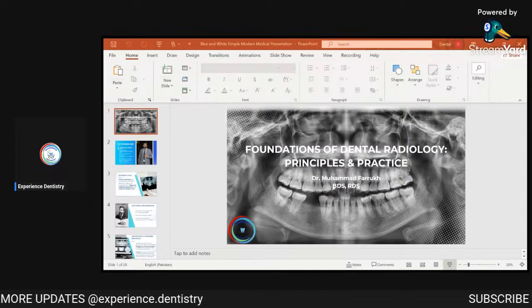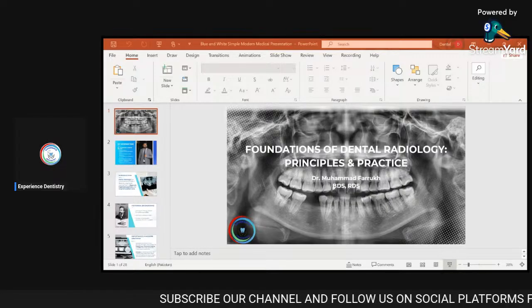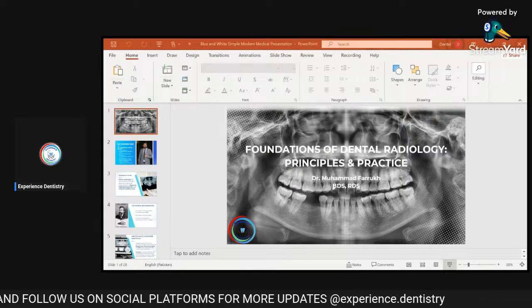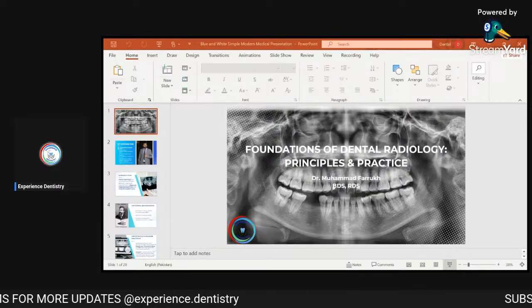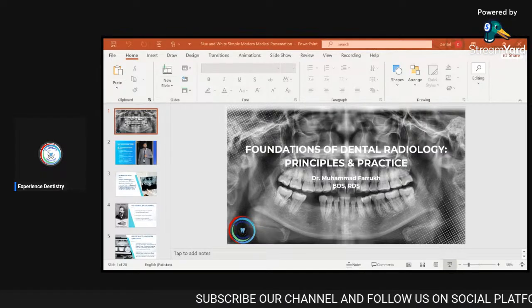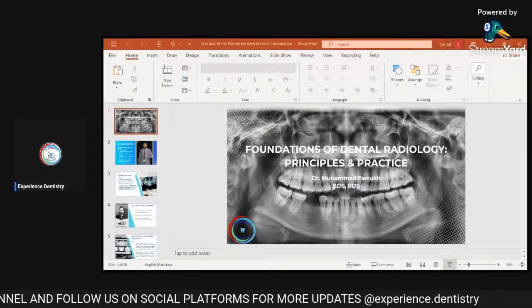Okay. Thank you. Then you go towards the endodontic evaluation. In endodontic evaluation, you need to assess whether the root canal is done properly or not, whether you have obturated properly and met the working length or not. So this you have to assess basically. In this picture, you can see that this is the maxillary molar and it's obturated. It has 3 roots, and this one is also going into the sinus, but it is basically well obturated.